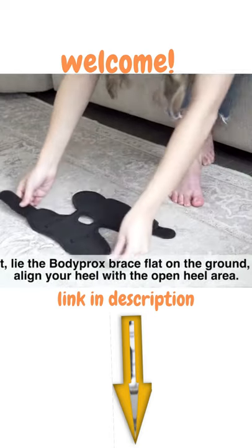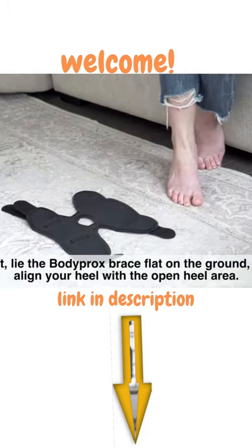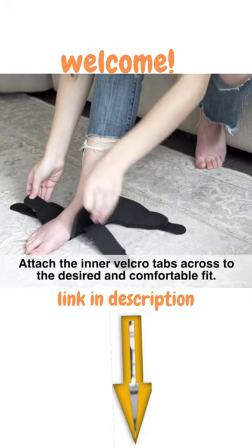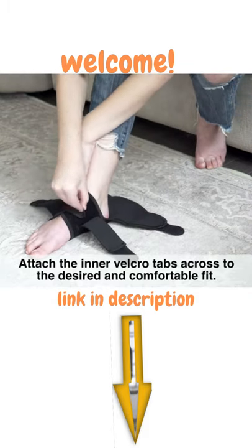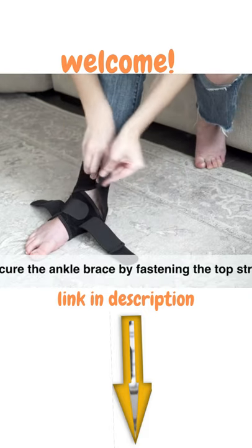First, lie the Bodyprox brace flat on the ground and align your heel with the open heel area. Attach the inner velcro tabs across to the desired and comfortable fit. Secure the ankle brace by fastening the top strap.